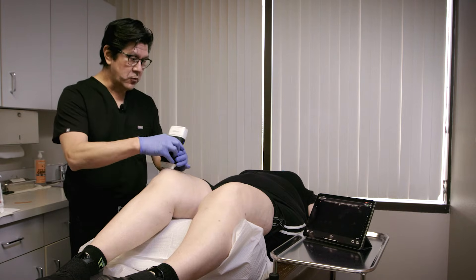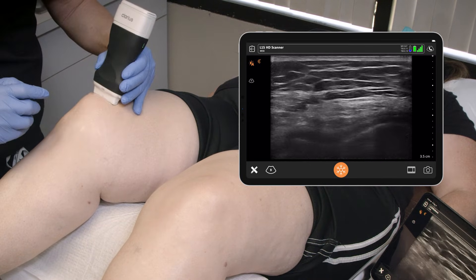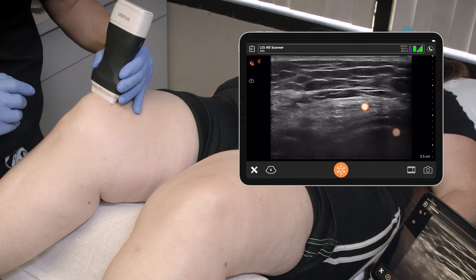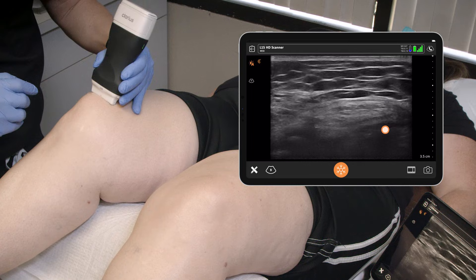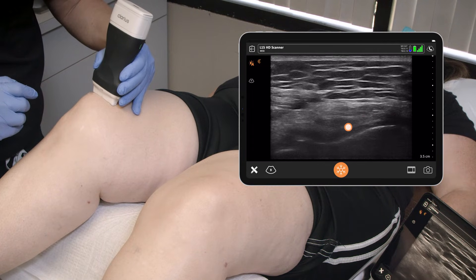Specifically, we're going to be using the ultrasound because as we look into the knee itself, we see the trochlea very nicely, and we're suprapatellar in this region. We can nicely see the quad. There's very little joint fluid within the space there, and that would be very hard to potentially hit if we were to do this blindly. So obviously we don't want to hit the bone, we don't want to hit the cartilage, and we definitely don't want to get into that tendon, as that could be very painful.